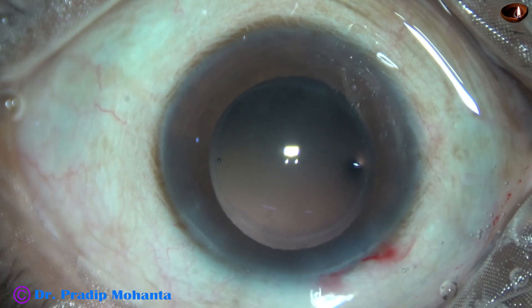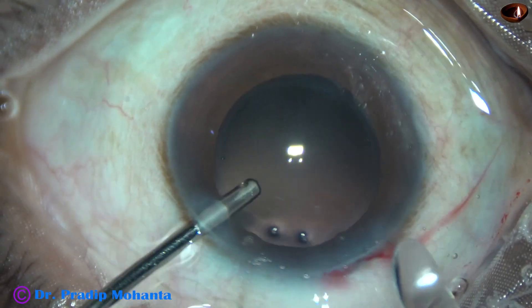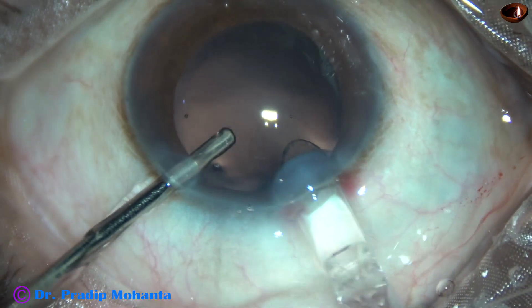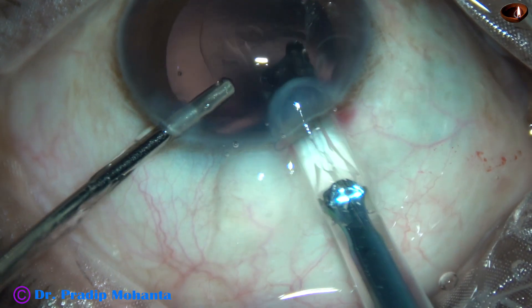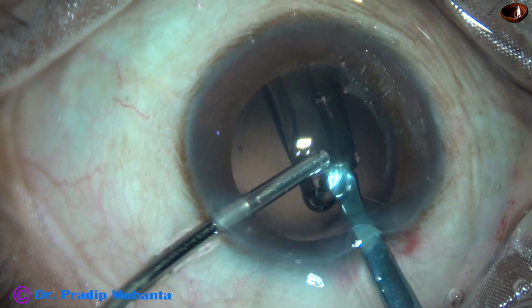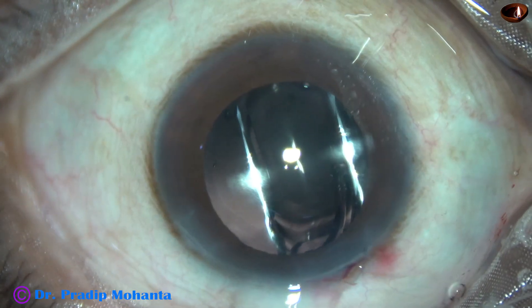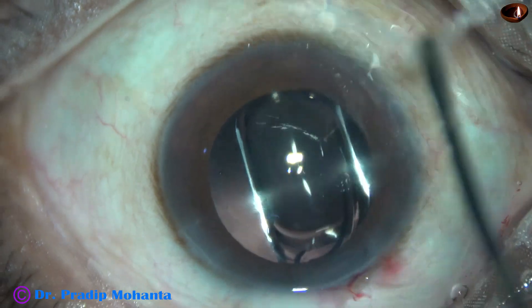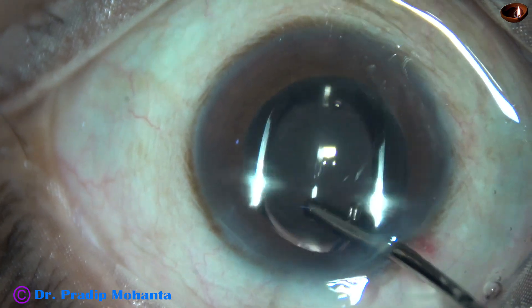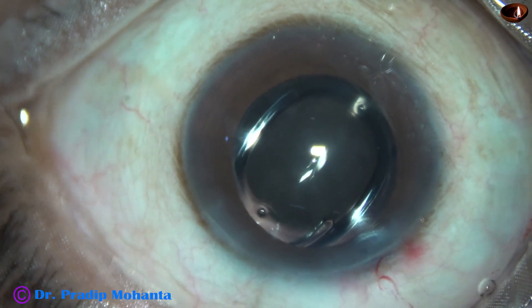Now a hydrophobic acrylic single-piece monofocal intraocular lens is being implanted in the capsular bag. This lens is from Johnson & Johnson — this is Sensor 1. It's a beautiful lens. I haven't seen any glistening in this lens — Tecnis 1 and Sensor 1.